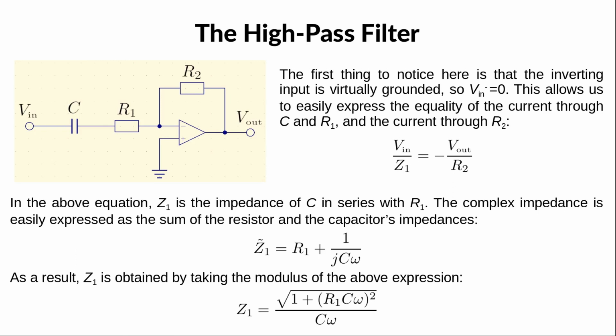The reason is that it contains a DC component that is due to the fact that there exists a constant potential difference between the points in the muscle. So if we amplify the signal, it will saturate and we won't see any difference between when the muscle is contracted and when it is not.